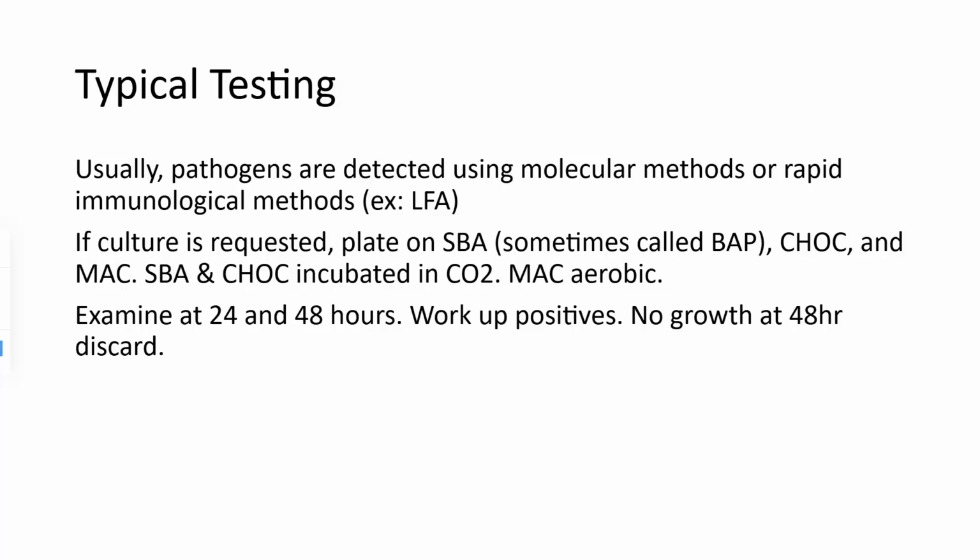And then MacConkey, if you remember when we talked about MacConkey agar, MacConkey contains crystal violet and bile salts, and that will select against the growth of a lot of gram-positive microorganisms. It also contains lactose, and lactose is used to make it differential. If organisms can utilize lactose, they're going to eat the lactose and produce a pink precipitate on the surface, so they're going to turn pink in color. If they cannot ferment lactose, then they're just going to remain the color that they naturally would be, or they would be like a clear type color on the agar.